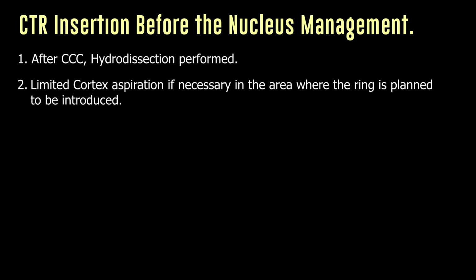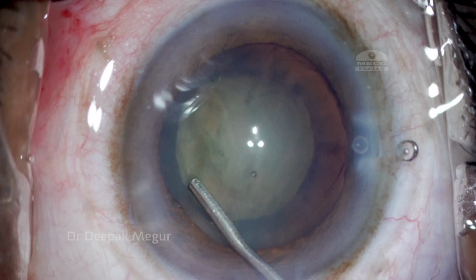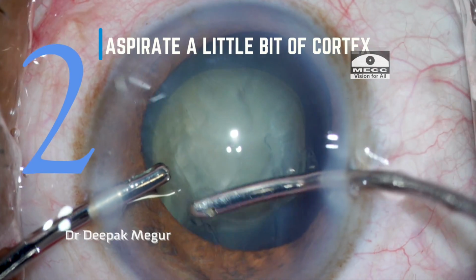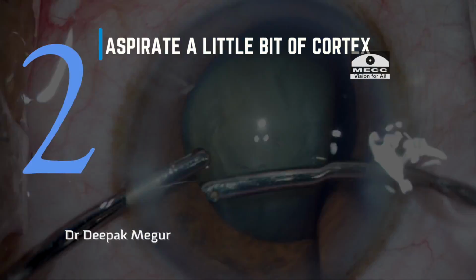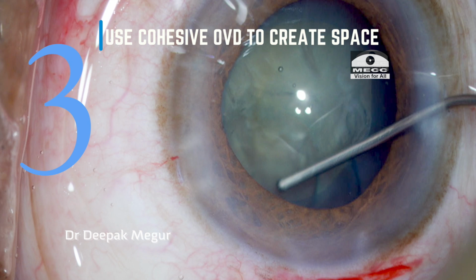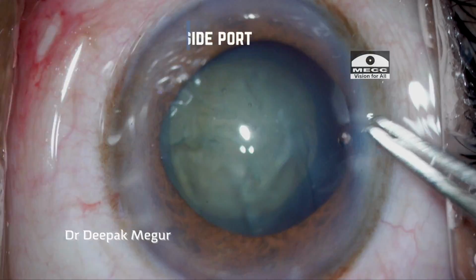A standardized protocol which I usually use is as follows. First, it is going to be cortical cleaving hydrodissection. Then aspirate a little bit of cortex if needed, depending upon the type of cataract which you're having. Use cohesive OVD to create space and flatten out the cortex away from the capsule. This aids in easier insertion of the ring and minimizes the chances of cortex entrapment.